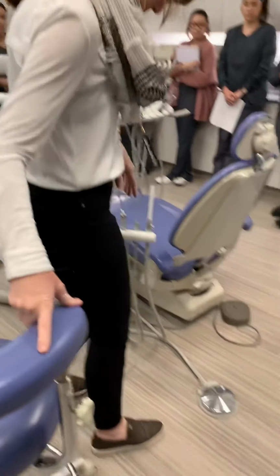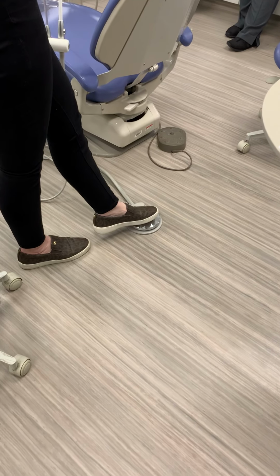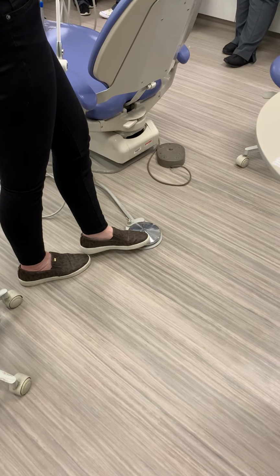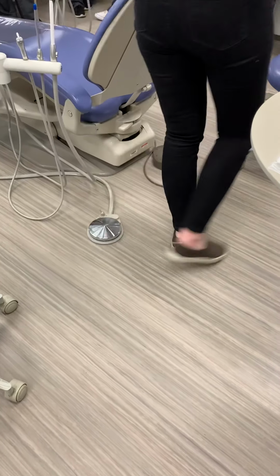This is the rheostat. It's the power to the handpieces. So it's the gas pedal. If you look at it like a car, the compressor is the engine. This is the gas pedal. That would be the key. Okay. This operates the chair.